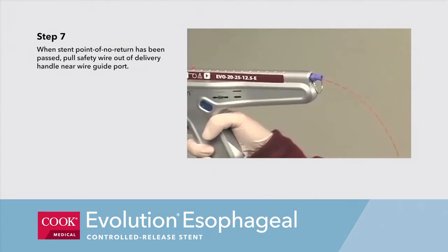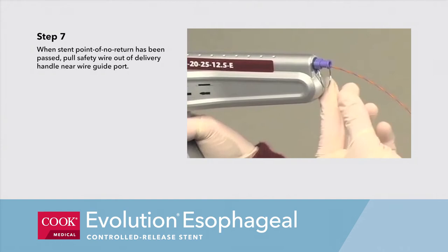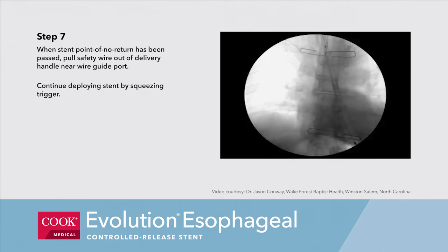Step 7b. When the stent point of no return has been passed, pull the safety wire out of the delivery handle near the wire guide port. Continue deploying the stent by squeezing the trigger.